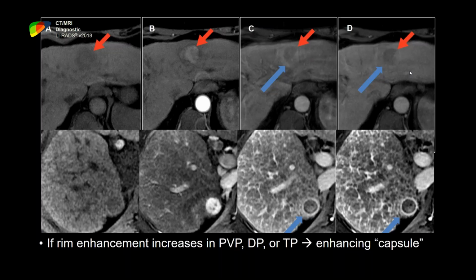Actually, I see a lot of cases, and then I'm confused whether to call whether there's a washout or not. Because according to the carcinogenesis pathway, sometimes we expect that the tumor has not yet developed its arterial hypervascularity. I think, look again at the definition. The definition is unequivocal. So I would not call it unless there is unequivocal, which is sure. Or what do you think, Claude?